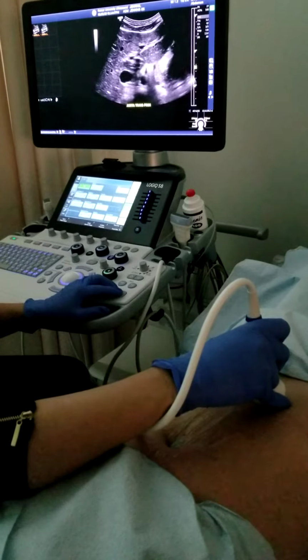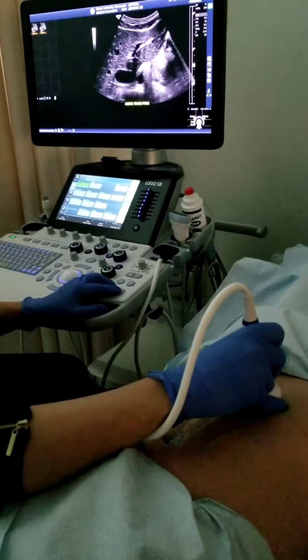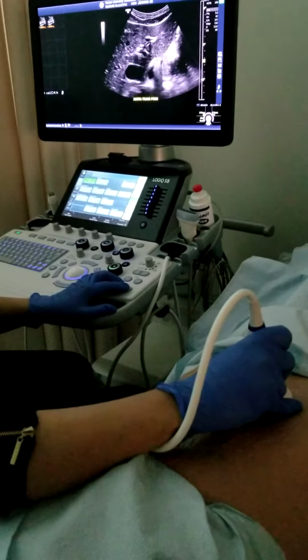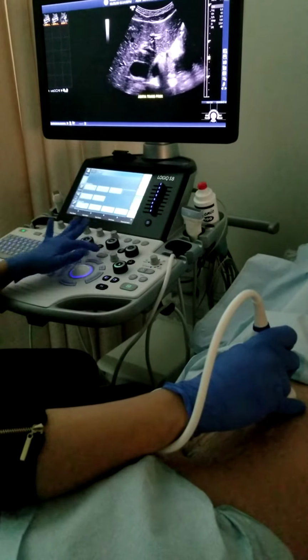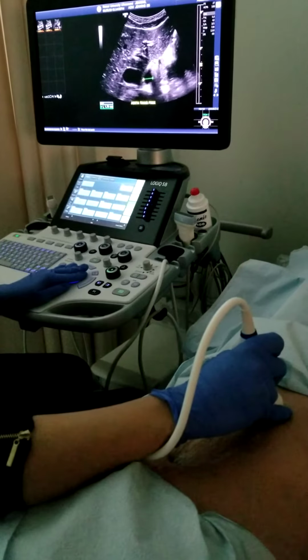So I'm going to keep coming a little more inferiorly until I can see that nice round aorta before any takeoff. So here's my first takeoff here, my celiac axis. So I'm going to scan superior to that and freeze. So here's my transverse prox, and I'm going to measure. That's good.